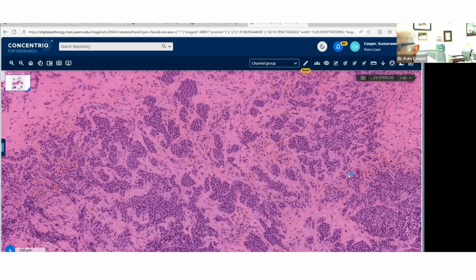Ooh, Nelson. I think this is the Nelson from Botswana, I may be wrong. He's a senior resident, just come back from his senior training. Now, he's making a very good suggestion. Clear cell sarcoma of soft tissue. Remember, I kept away melanocytic markers. And remember, I kept away EWSR1. So you're spot on there, Nelson. Yeah, this is a clear cell sarcoma occurring in the dura. I've never seen one in that location.